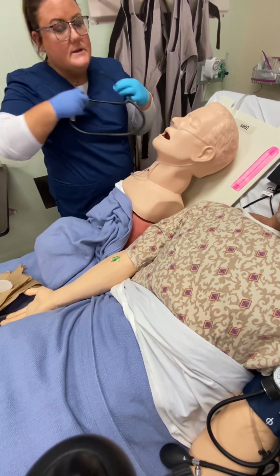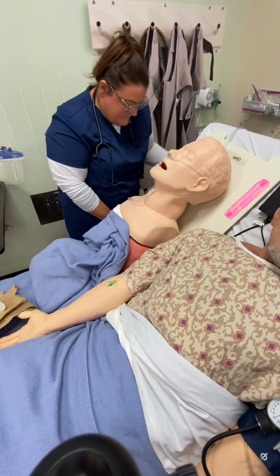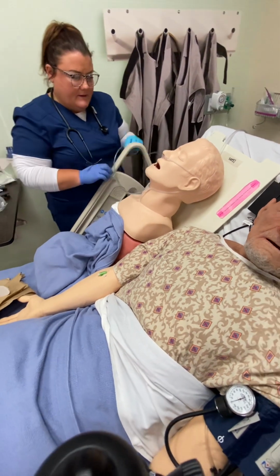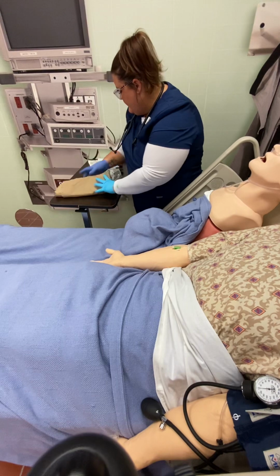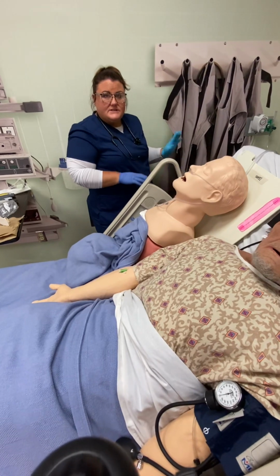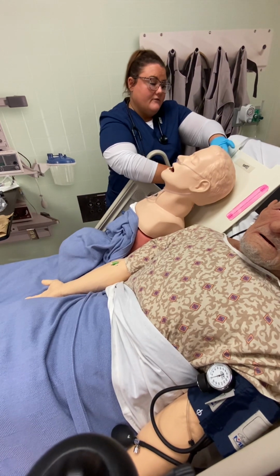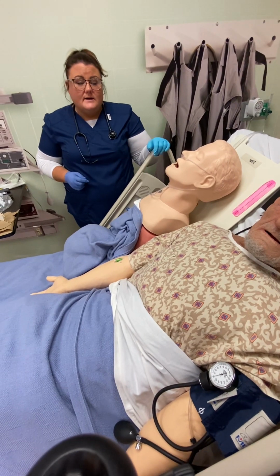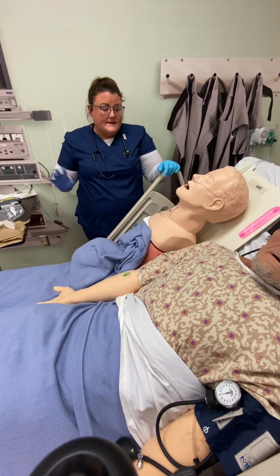Okay, I don't hear any secretions in there. All right, Mr. Smith, you did a great job. So now I would just go ahead and clean up my mess around him. I'd keep my vent in here on standby just in case I started hearing stridor or anything like that. I would keep his suction here for him. And I would go ahead and let the doctor know that we've got him extubated.